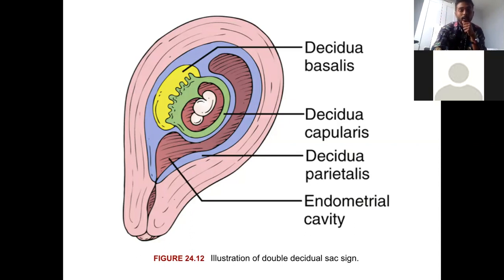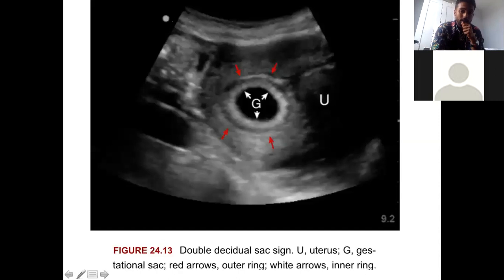Okay, so now, these are some of the normal things. A female comes in pretty young into the pregnancy. We're looking for an ectopic pregnancy. Depending on what time of the pregnancy she's in, we look for these normal signs of fetal growth in the intrauterine space. If she does have that, that rules out ectopic pregnancy. One of these is called the double decidua sign, which is basically what I explained.